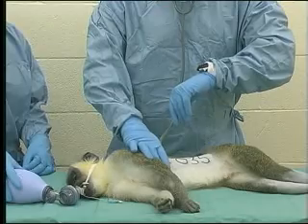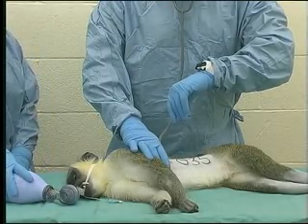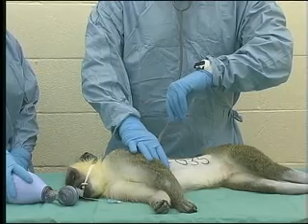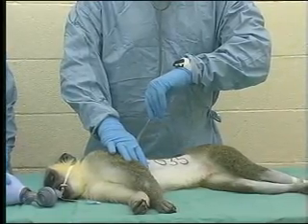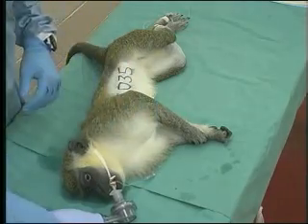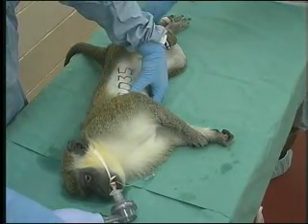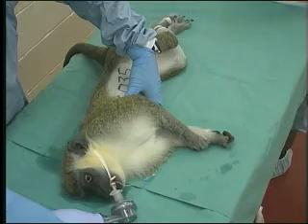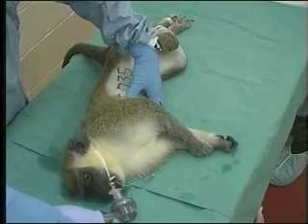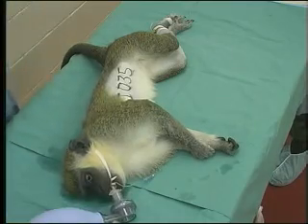Temporary cessation of manual ventilation will allow the student to observe the atropine-induced reversal of the muscarinic clinical signs of the cholinergic crisis. Ventilatory assistance must be provided to supplement the respiratory efforts made by the animal until the animal's own respirations can maintain normal tissue oxygenation. Observations of the recovery must be noted and recorded on the animal health sheet.